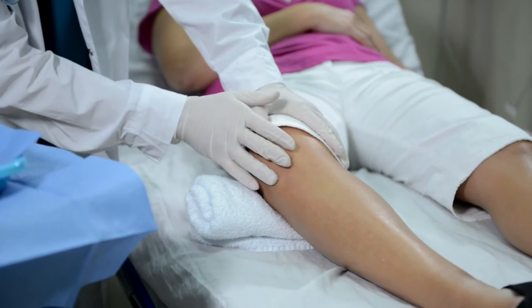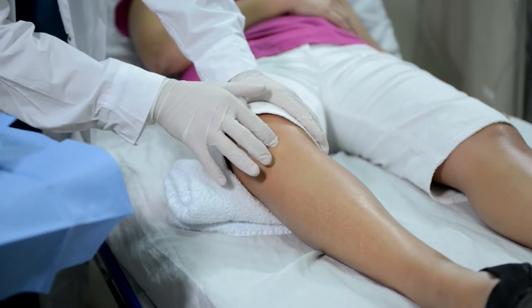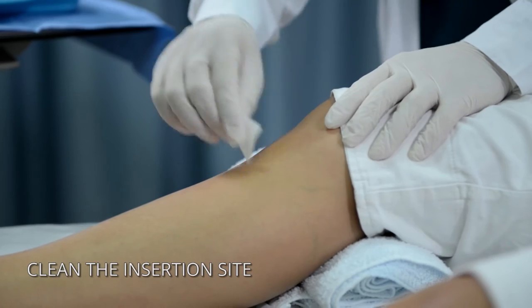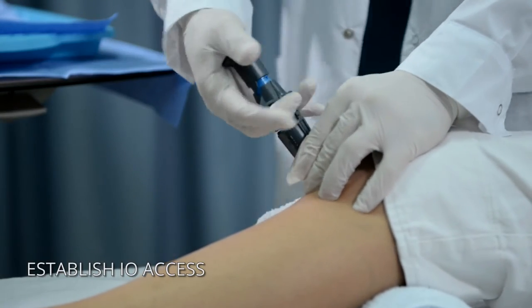Select appropriate insertion site and use prep pads to clean the area. Deploy the NEO to achieve I.O. access.